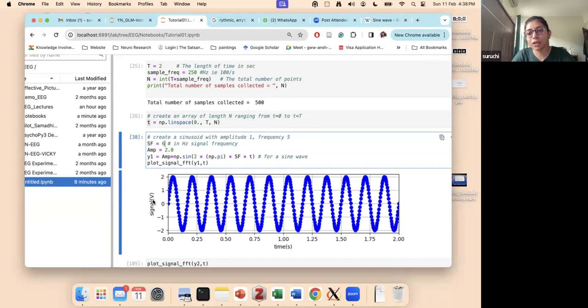Signal has multiple names. It could be signal intensity. Because amplitude is only at the peak, right? All these values are also of the signal. Amplitude is only the value at the peak, and it is very important, the value at the peak. But all of these data that you collected, they're all calculating signal. But what you're actually measuring is voltage, like we discussed, right? So it's signal voltage. Normally people will write, ideally they should write voltage. If it's an EEG, I'm just giving you some demonstration, right?